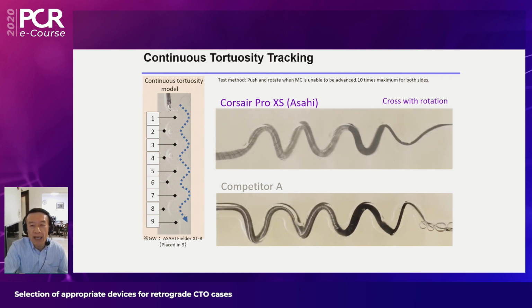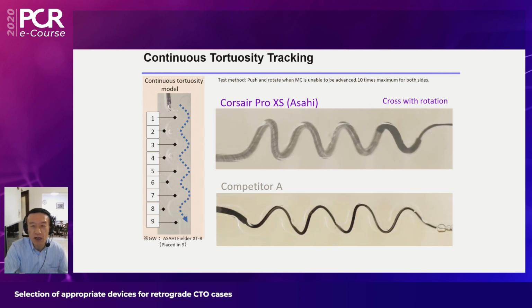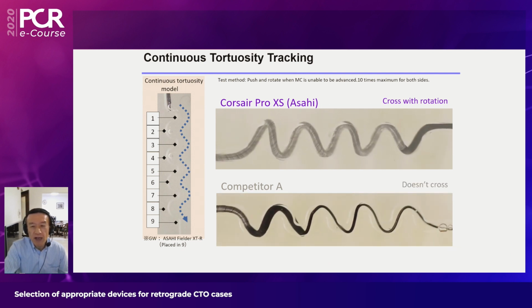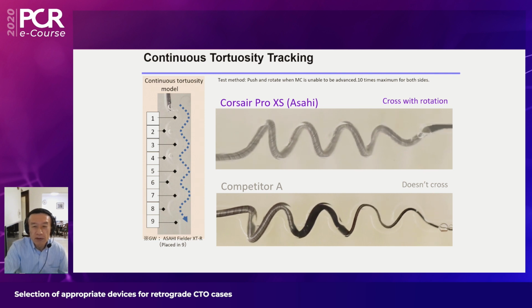So you need to wait a couple of seconds to transmit the power and advance forces at the tip. That is the key for successful advancement. But other than that, you probably have more freedom and can go through higher resistance parts.